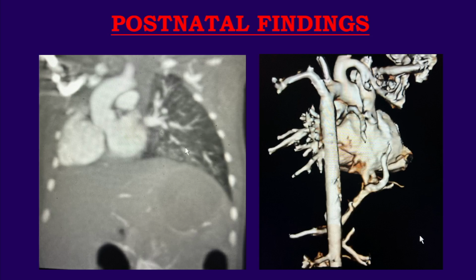I let you decide if it looks like the Turkish sword or not. I think that our radiologists have a great sense of imagination, but I think what's important for us is that we are very diligent about what we are looking at. We are very strategic, systematic, and then we can pick up those rare malformations.